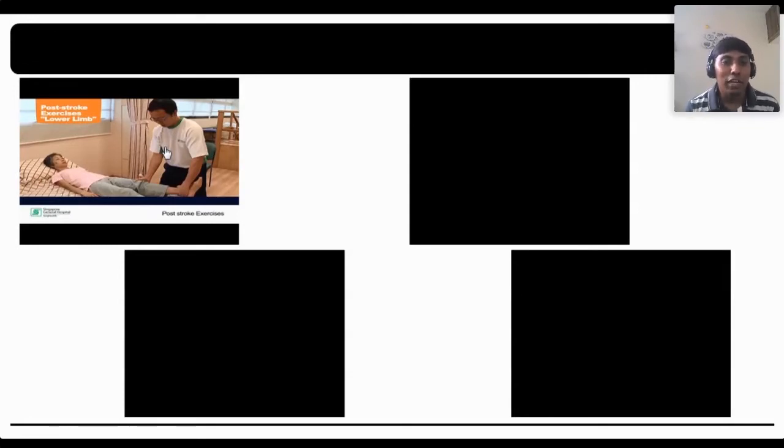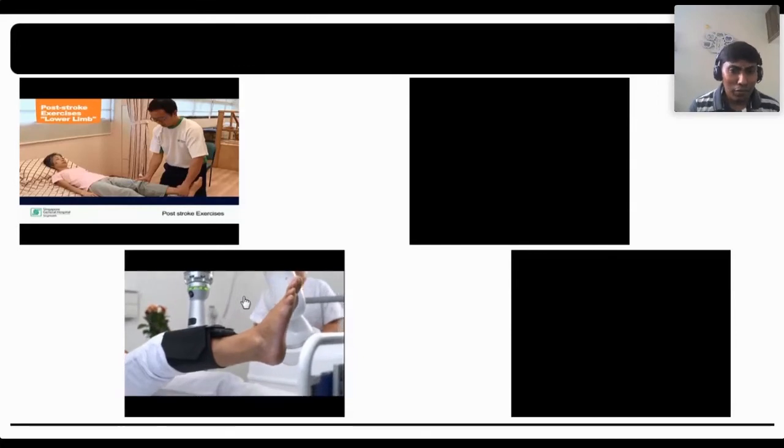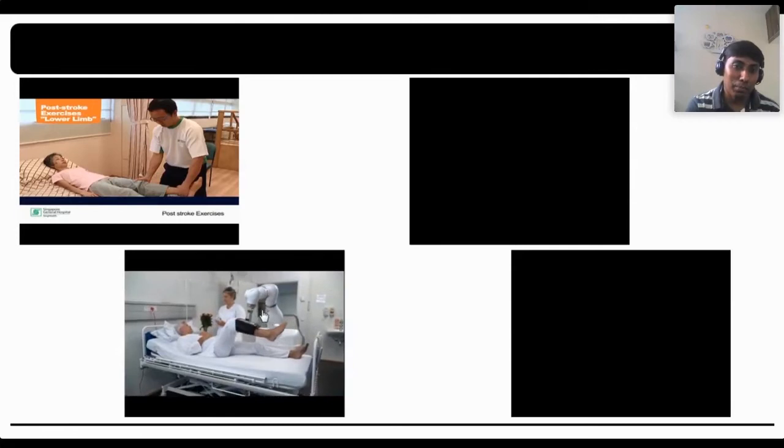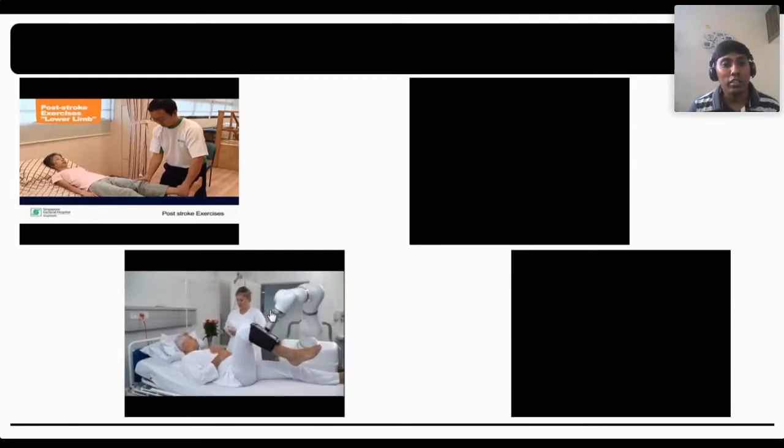Definitely his body, his supporting system, will not support. So in order to enhance this, people have come up with a robotic based system. For example, what this person tried to do, the same thing this particular robot, a Kuka robot, is doing. So this is what we call a stationary trainer, specifically for the bedridden patient.